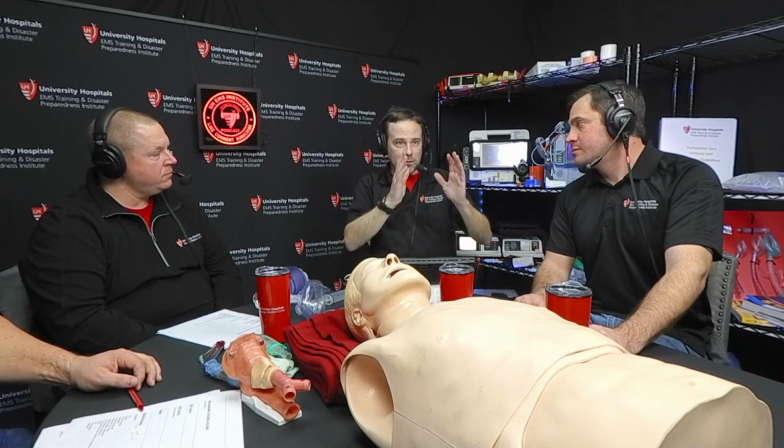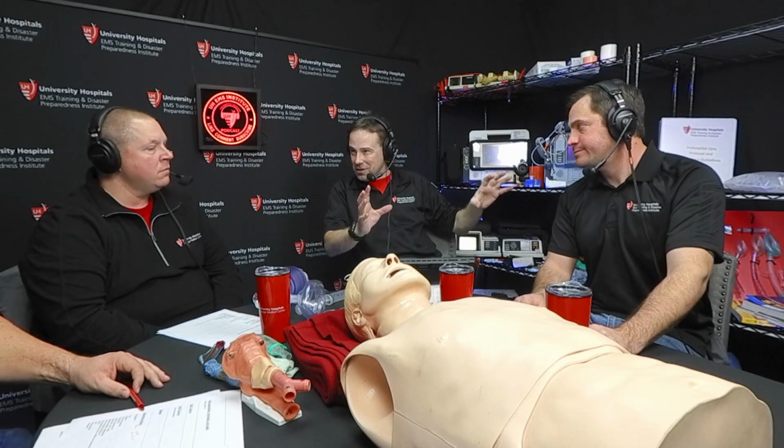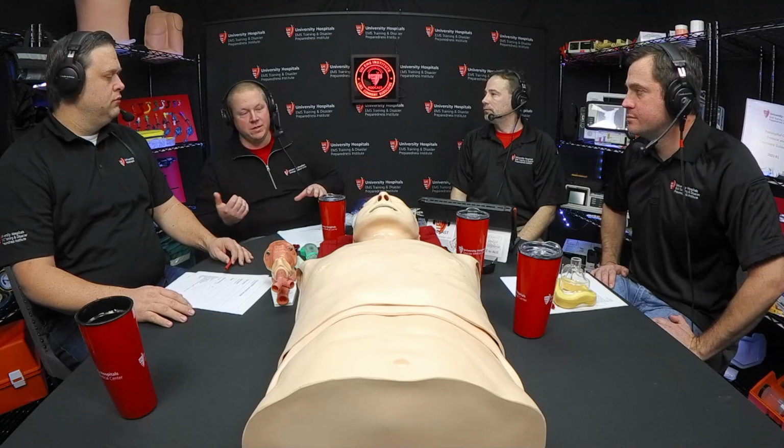So again, even if you're putting somebody on CPAP and then transitioning to a BVM, you're losing part of the advantage of the CPAP, right? Correct, with the PEEP, because you have continuous. Without a PEEP valve, right? You have it continuously.